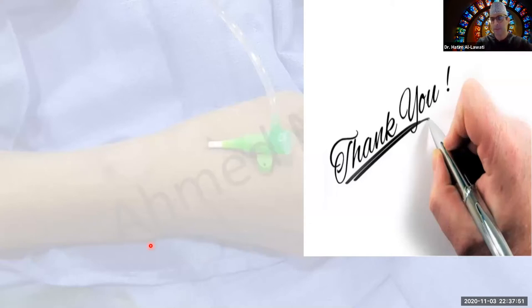So in places where the Impella is readily available and commonly used in situations like these, you'd find the operators inserting the Impella right off the bat. Or you'd have two operators working side by side, one putting in the Impella and the other trying to cannulate the left main and restore flow. And then there are situations where the operators think the priority is to restore flow. So there's no right or wrong answer here.